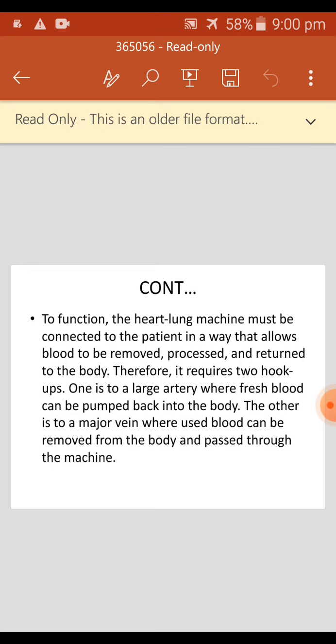Second one, venous cannulation. Venous cannulae drain the patient's blood from the venous vascular system to the HLM. The type and size of the selected cannulae is determined by conditions that are similar to those on the arterial side. Vent catheters are inserted to protect the temporarily arrested heart, and especially the left ventricle, from overextension due to blood flowing back from the bronchial circulation.